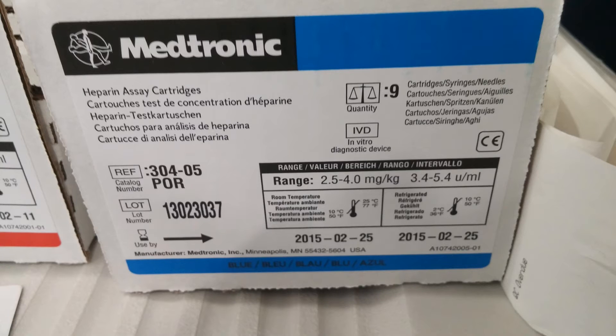Round the target heparin concentration generated by the HDR up to the next 0.5 milligrams per kilogram, and choose an appropriate heparin assay cartridge in which that target ACT falls in the middle of its range. The heparin assay cartridges work by utilizing various known quantities of protamine in each of their wells. By comparing this information with the known quantities from the HDR curve, the HMS Plus is able to accurately calculate the current heparin concentration and provide the required heparin dose to maintain the target concentration.